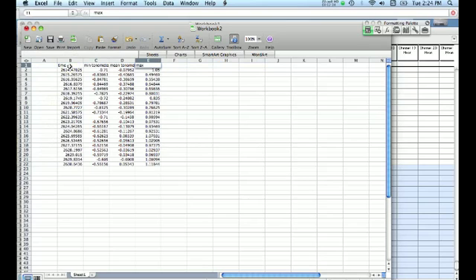This is the maximum in the tonometer channel. The other things that we need to know are the brachial pressures: brachial diastolic blood pressure, brachial mean arterial pressure, and brachial systolic blood pressure.